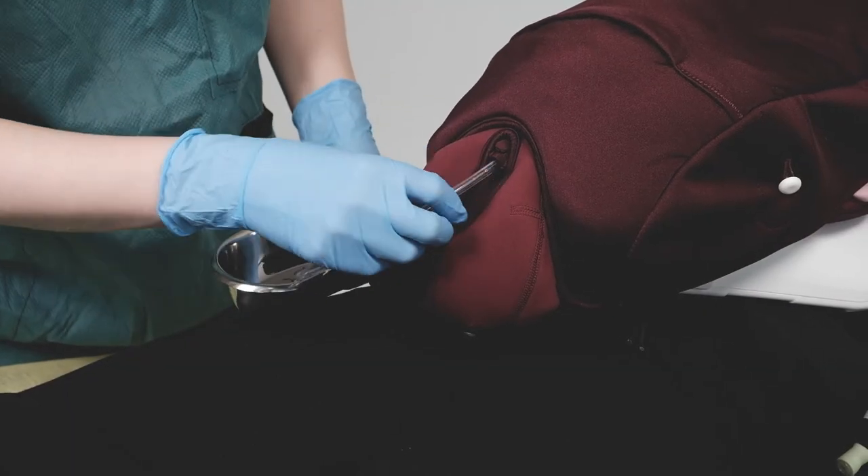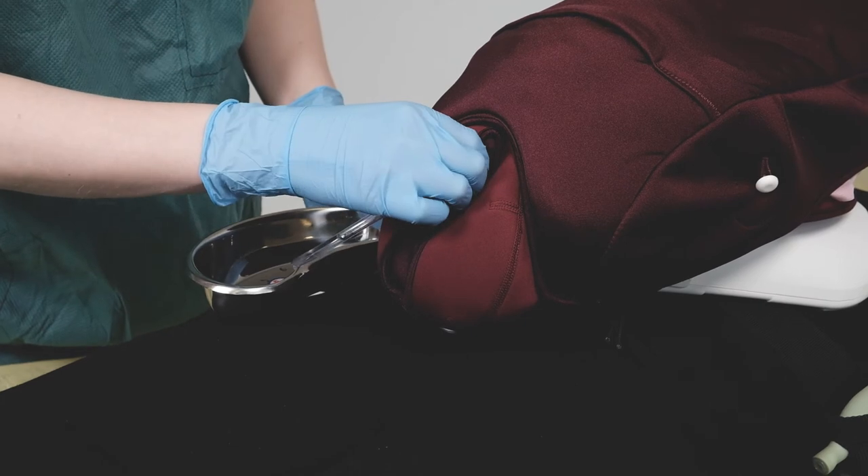If it has not been done earlier, a team member catheterizes the woman and empties the bladder.